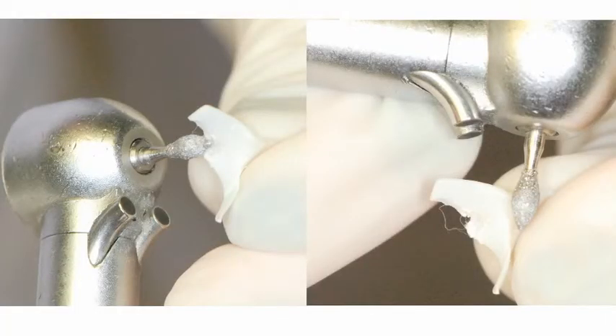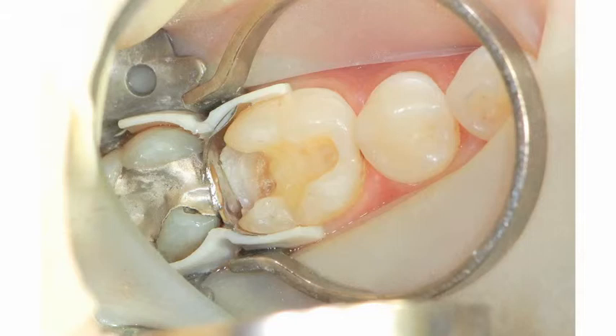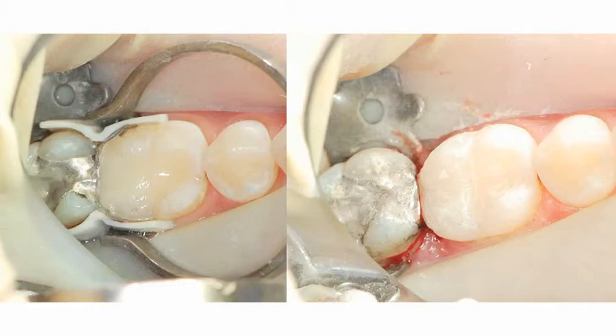Since there is a rubber dam in place, the ABC Wedge will need to be modified to clear the clamp. I'll also trim the embrasure area of the wedge to broaden the contact. The ABC Wedges were placed on the buccal and the lingual, sealing off the gingival floor. A separating ring is then seated along the grooves on the back of the wedges. This not only centers the pressure appropriately, but also secures the ring so they are less likely to pop out of the mouth. The tooth is then incrementally filled with composite.